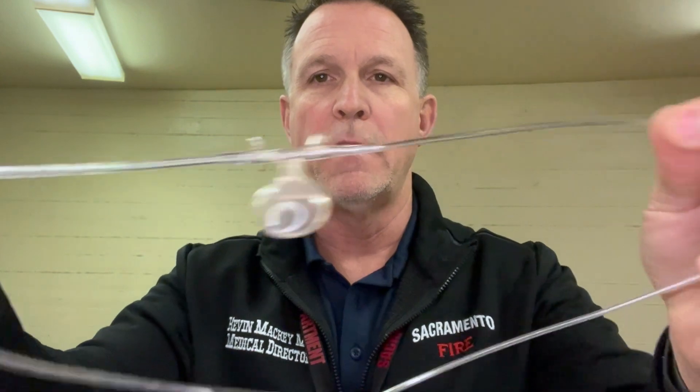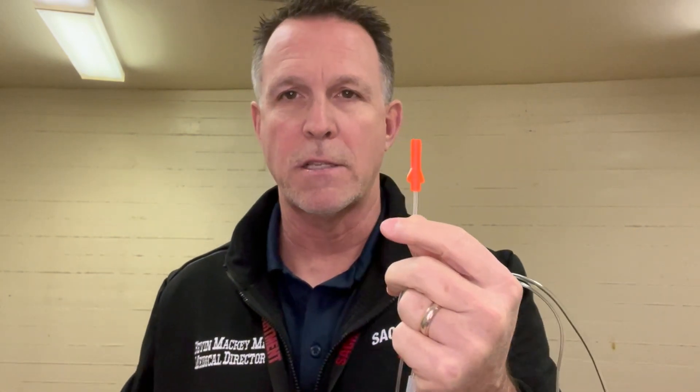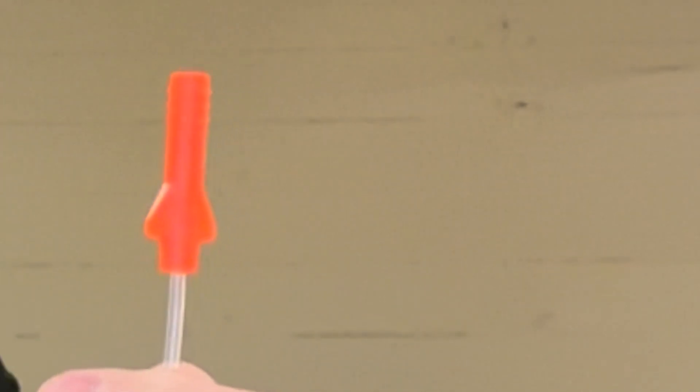If you look at the tubing, one side is pretty thin, one side is pretty thick. On the other end are two connecting devices — you'll recognize it right off the bat. This is like what we normally screw into our End-Tidal CO2 adapter on our monitor. It functions exactly the same way. It'll give you waveforms and numbers to measure End-Tidal CO2. The other end has an oxygen adapter, but you do not have to use it. You can use it if you want to add more oxygen, but you don't have to.